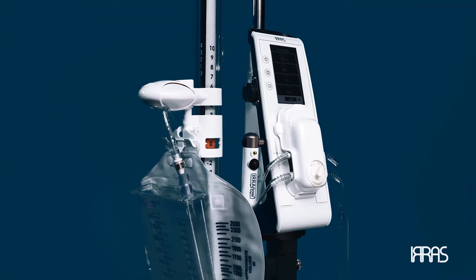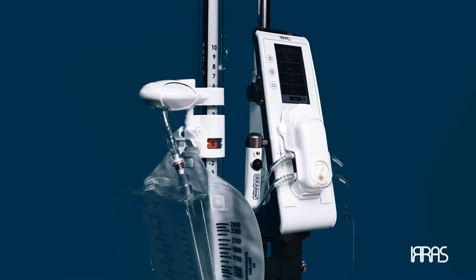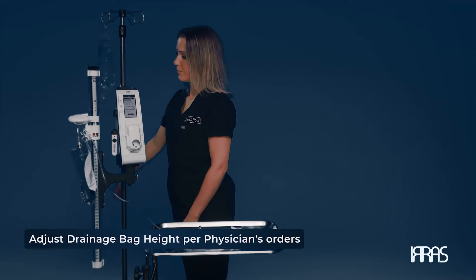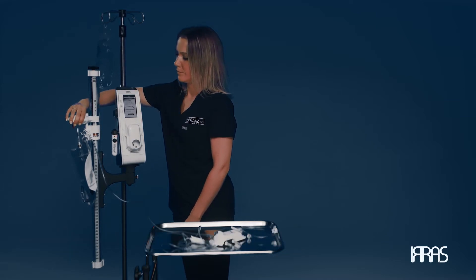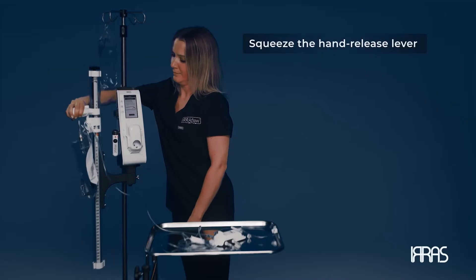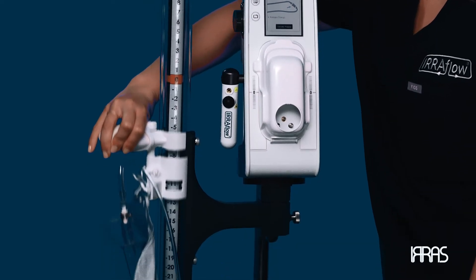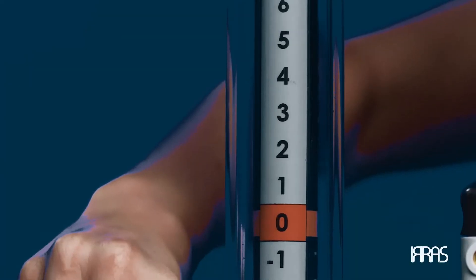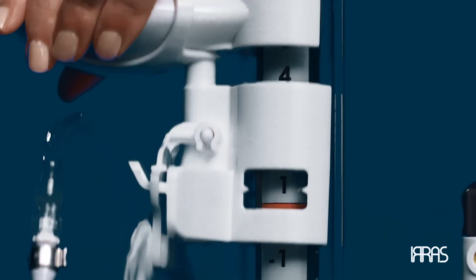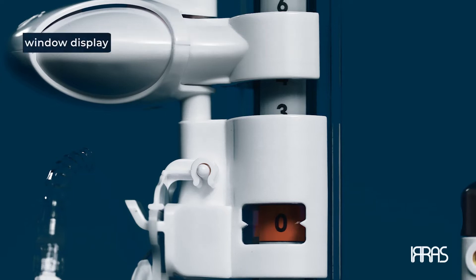Now that you have attached and locked the drainage bag into place, it is time to adjust the drainage bag height. Per physician orders, adjust the height of the drainage bag on the drainage collection system by squeezing the hand release lever. Squeezing the lever will allow you to move the drainage collection bag up and down to your desired bag height. The exact height of the drainage bag will appear in the window display, identified by two arrows on the drainage collection system.